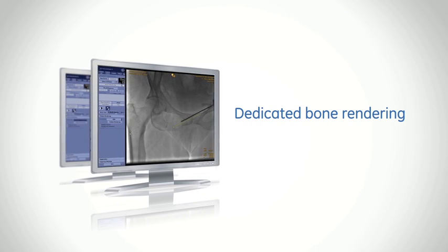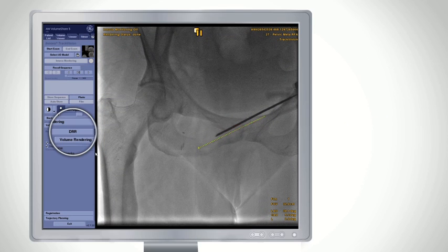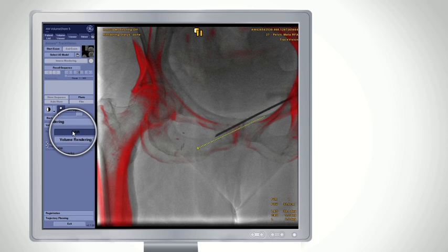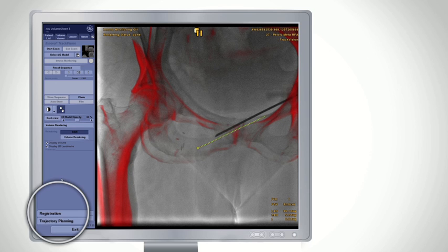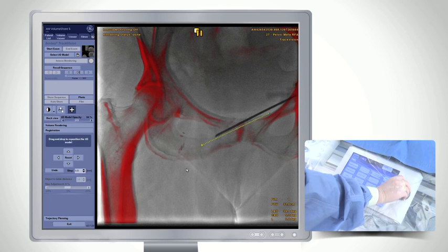Check for correct registration between your planned trajectory and your patient with dedicated bone rendering, as you can see here in red, and easily compensate patient movement at table side.